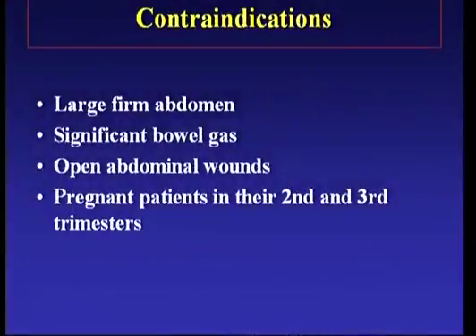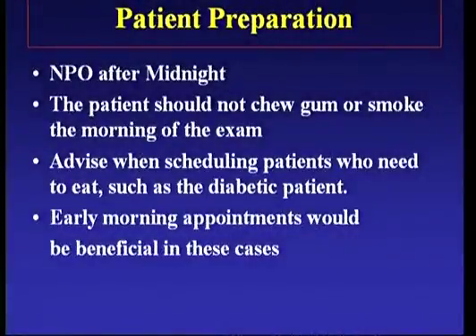The most common contraindications for this examination include a large firm abdomen, the presence of significant bowel gas, open abdominal wounds, and pregnant patients in their second and third trimesters of gestation.